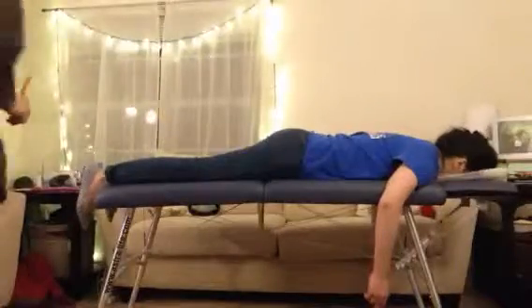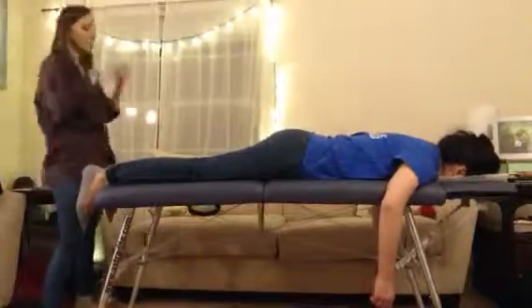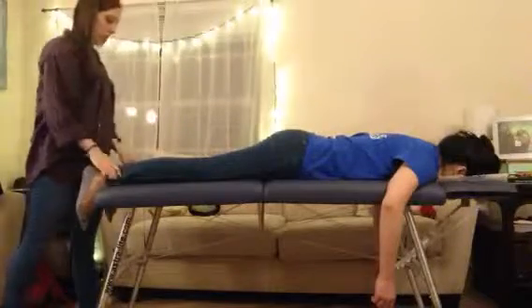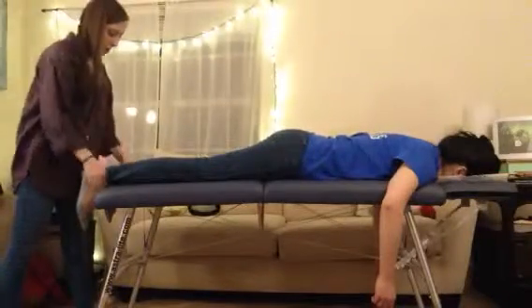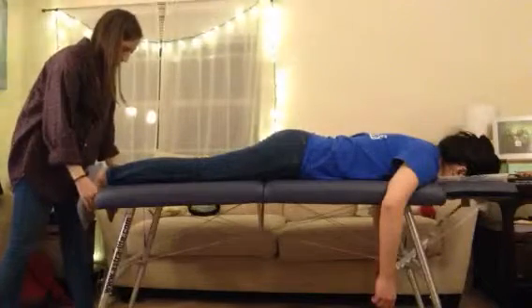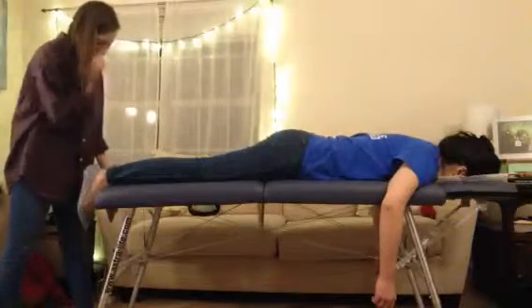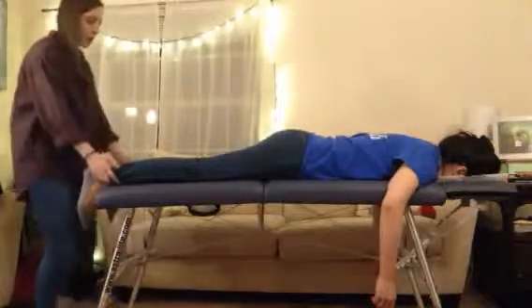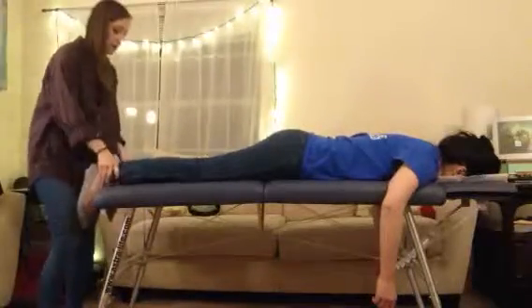Okay, so this is my TRT final. First thing we're going to start with is patient placement. We want to make sure they're centered onto the table and at the foot of the table. We want what would be the shoelaces of the shoe at the end of the table. There would also be a wedge here. Okay, so she looks pretty good.